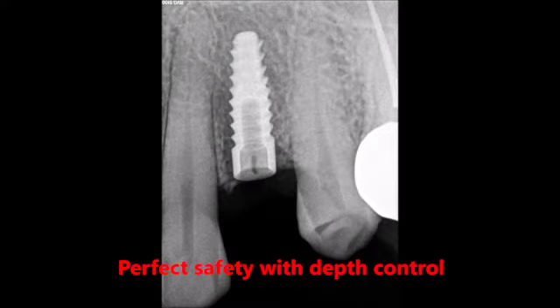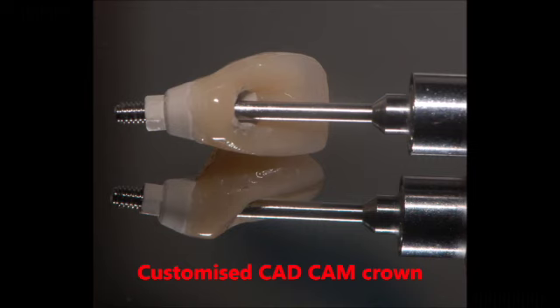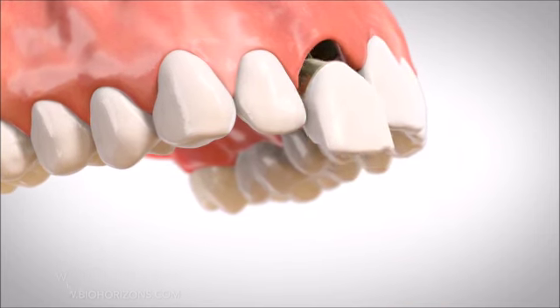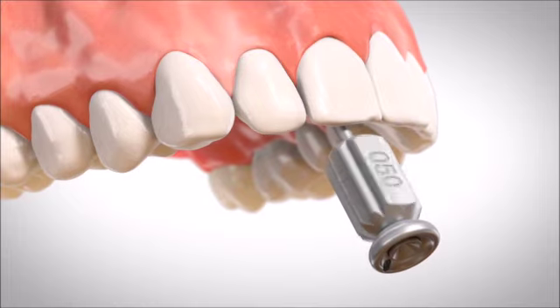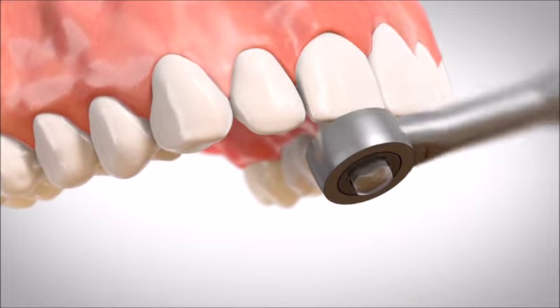With this procedure, there is perfect safety with regards to the position of the implant and with regards to danger of any important anatomic structures. No injections, no cuts, no stitches, minimal discomfort. You can even plan your CAD CAM crown even before placing your implant, so that immediately after the implant is inserted, the crown can be placed and the patient walks out with a fixed tooth in the mouth.